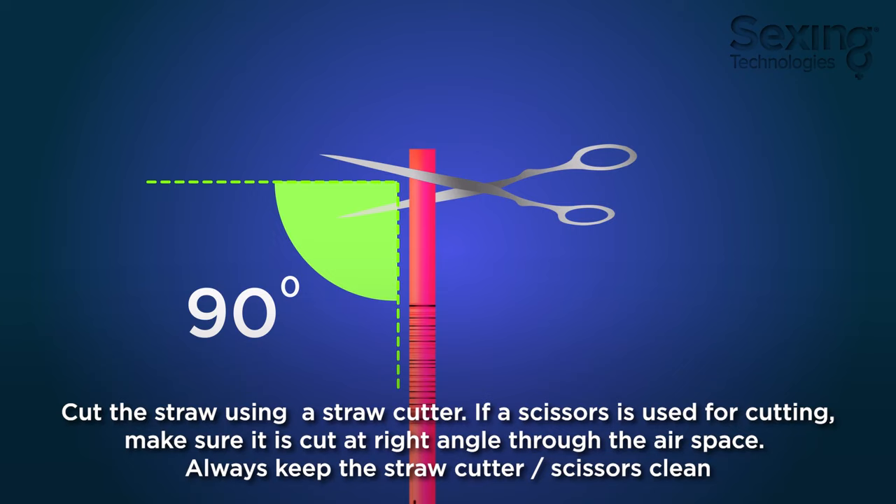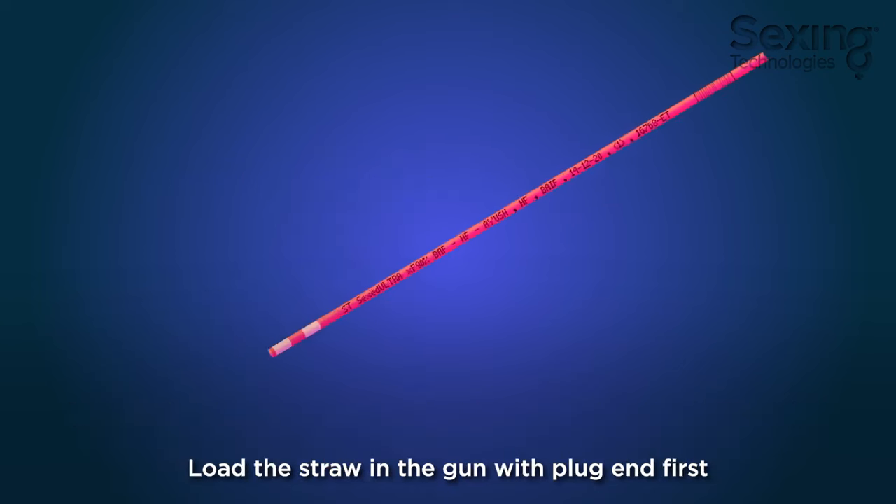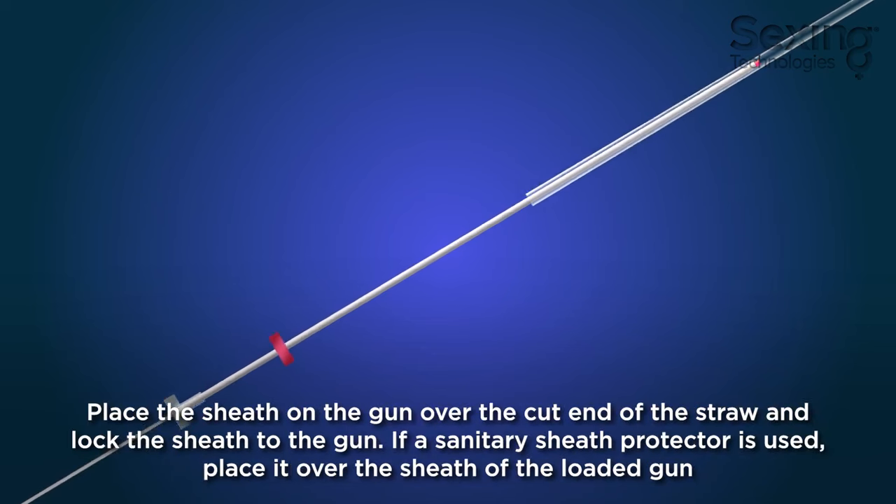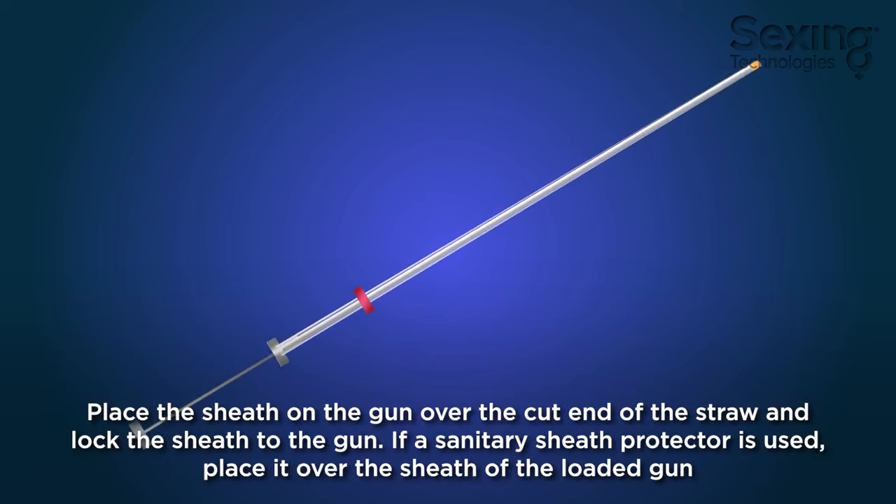Always keep the straw cutter or scissors clean. Load the straw in the gun with the plug-end first. Place a sheath on the gun over the cut end of the straw and lock the sheath to the gun. If a sanitary sheath protector is used, place it over the sheath of the loaded gun.